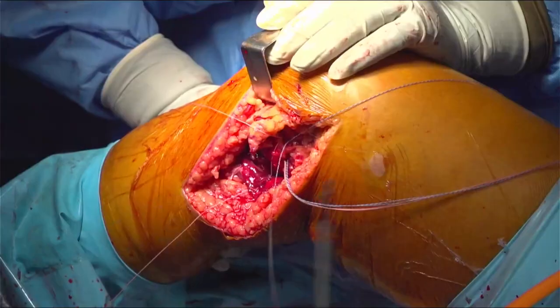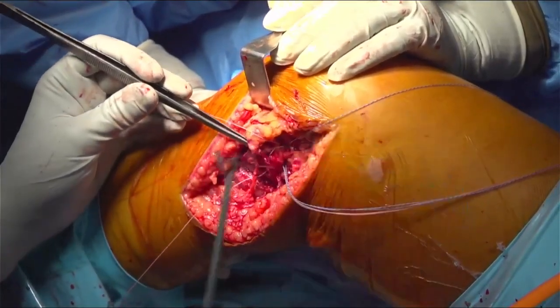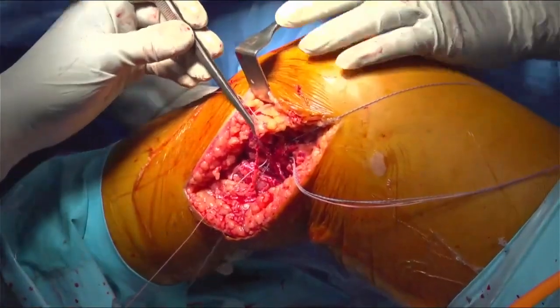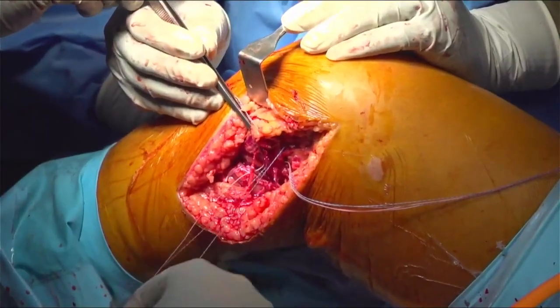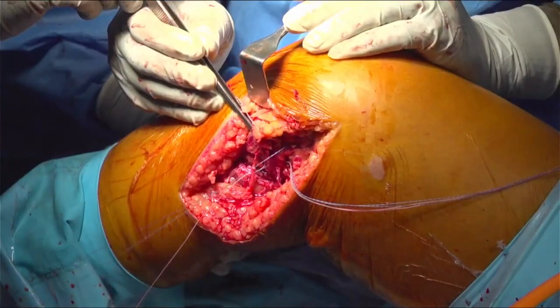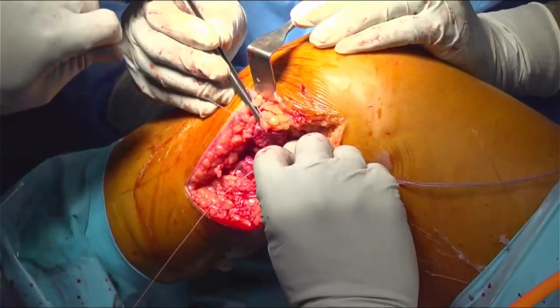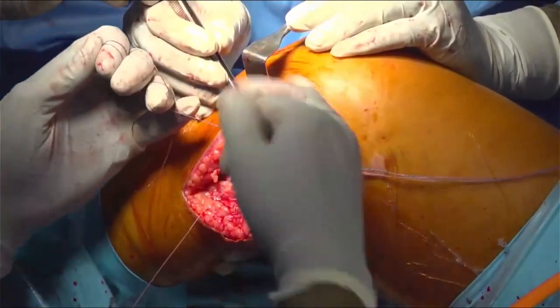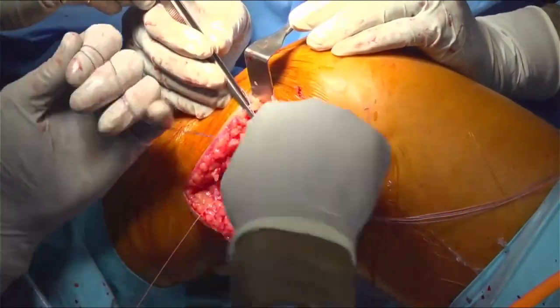So this first pass ST is a rotator cuff repair device, but this works very well in this scenario because we want to close the tissues properly. So here, just hold it please. And what I will do is I'll just close these sutures back into their place. Okay. So this closes my tissue very nicely and appropriately, okay?